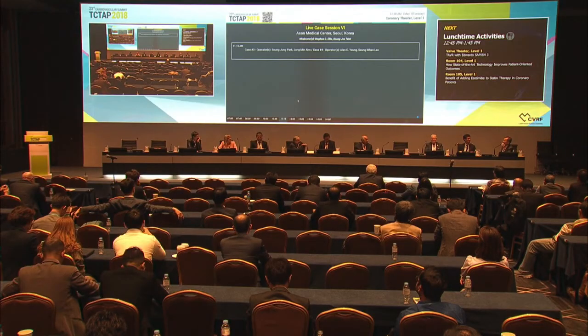Yeah, I can make a comment. What really matters is what's called microcalcium. The size is between 5 and 65 microns. IVUS unfortunately cannot detect it, but IVUS can show so-called spotty calcium. We did a pretty thorough literature search, and the definition of spotty calcium, either with IVUS or CTA, is very vague. There is no clear definition. So microcalcium is not easy to detect, even with OCT.